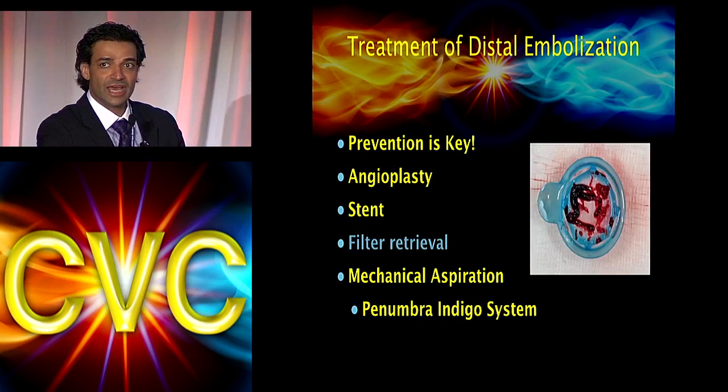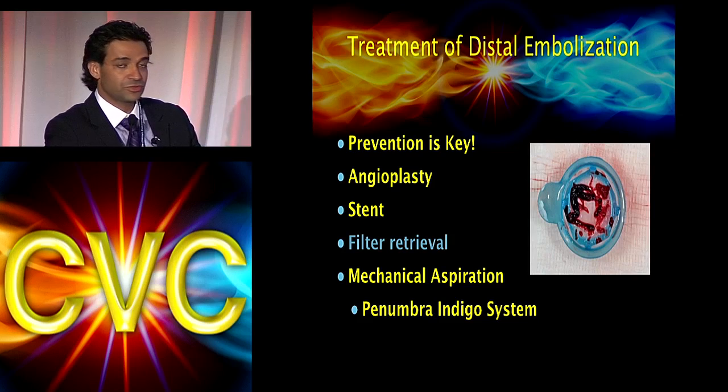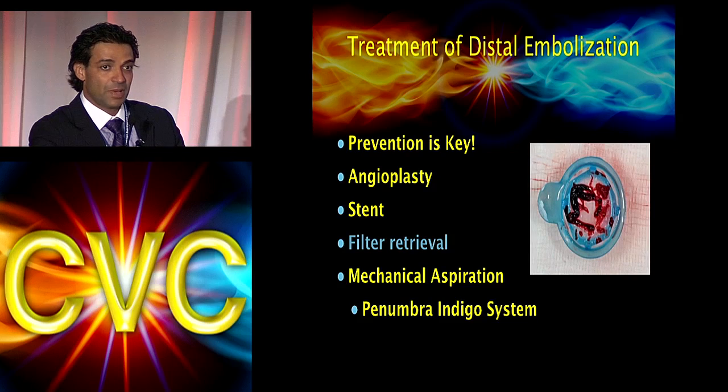So you will have embolic events at every single stage. Some might be clinically significant, some may not. So there's a couple of ways that I deal with these. What I used to use is a filter. And what I would do is go past the debris.